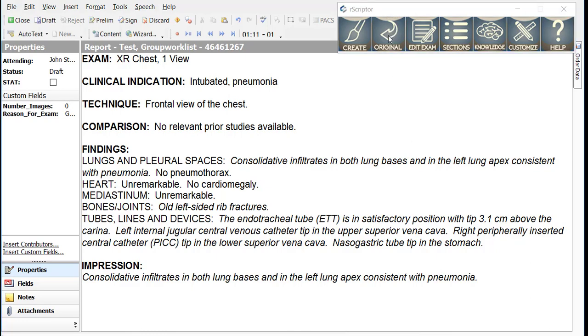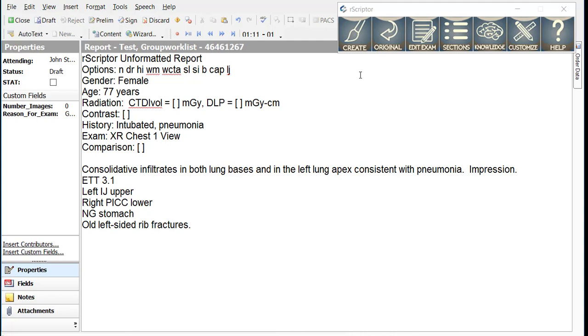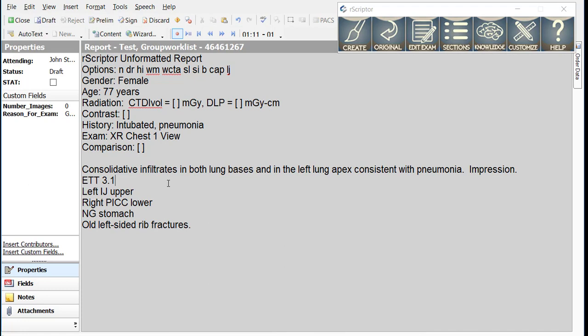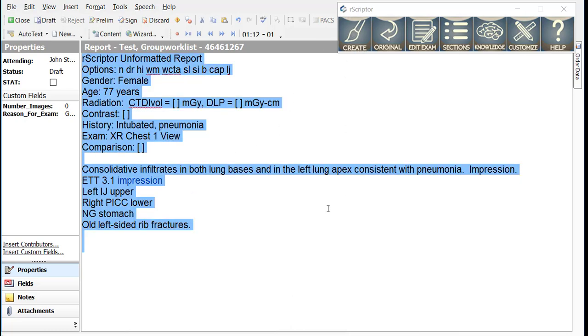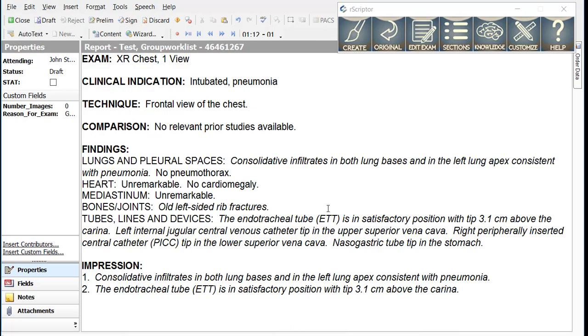If we go back to the original report and say this patient was just intubated and they want to know the location of the ETT, in that case I would add this finding into the impression by simply adding impression. As before, with smart macros, we do not want to add punctuation. So we would simply say impression, which would copy the ETT location into the impression.